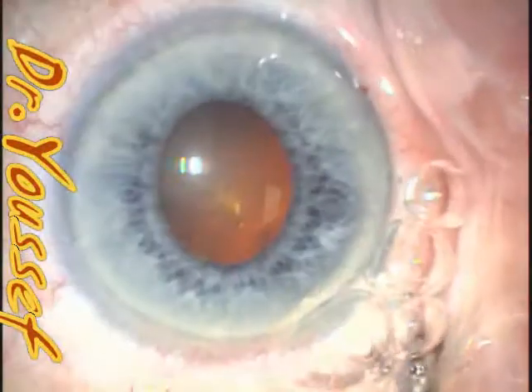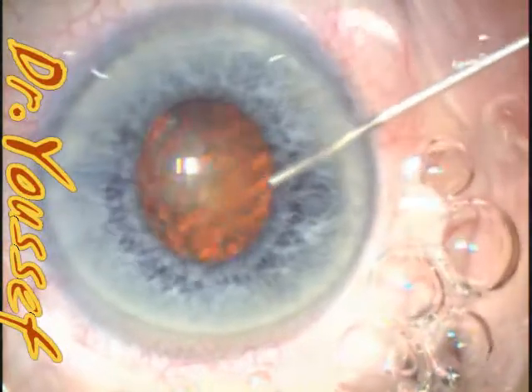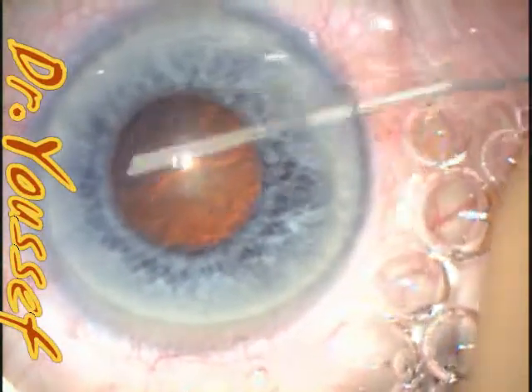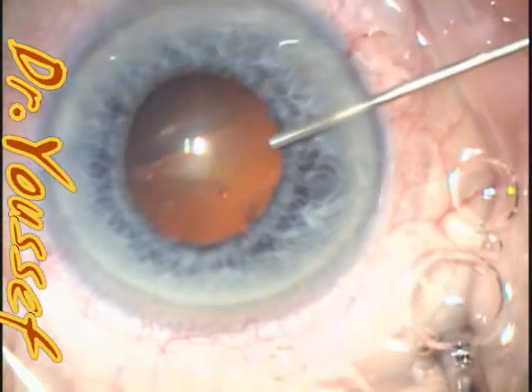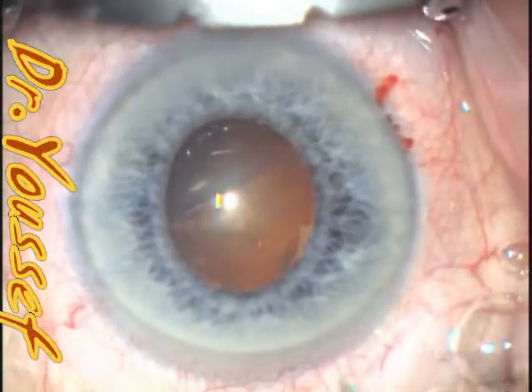Hi, I'm Dr. Yusuf. I'll be presenting to you today this case of intraoperative floppy iris syndrome due to Flomax, for which we needed to put in the Malyugin ring, and we had a small complication from the J-Cannula because of the poor visualization.